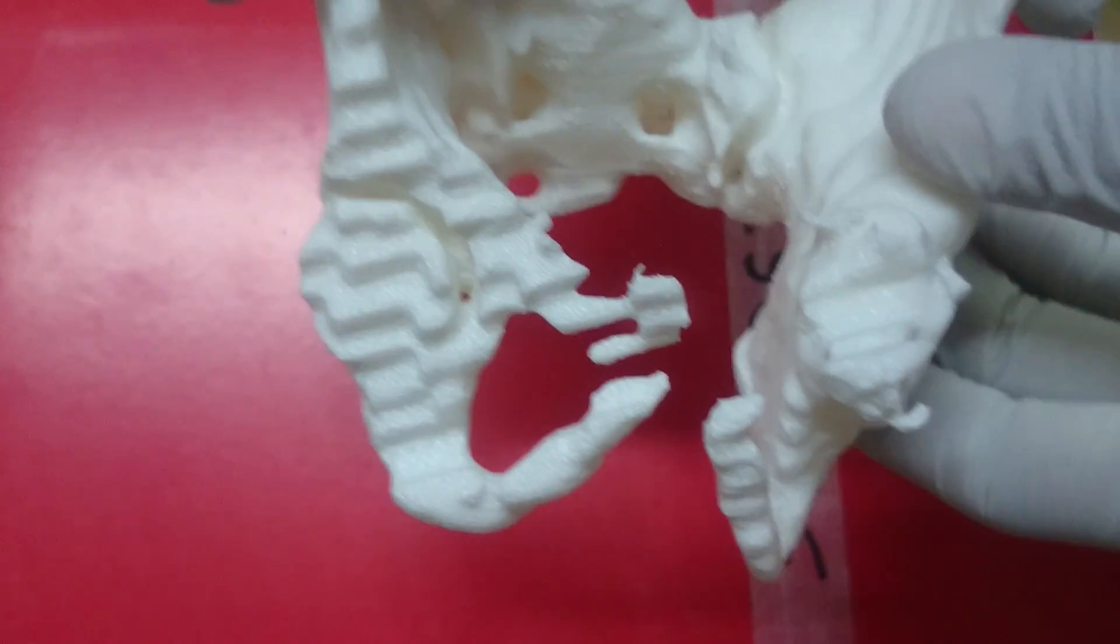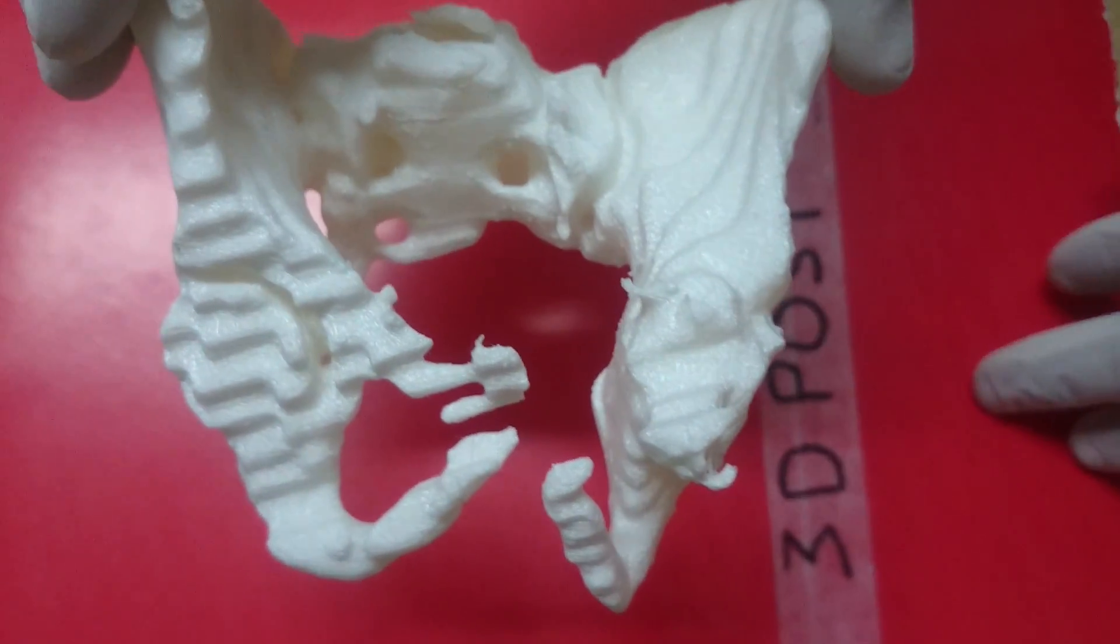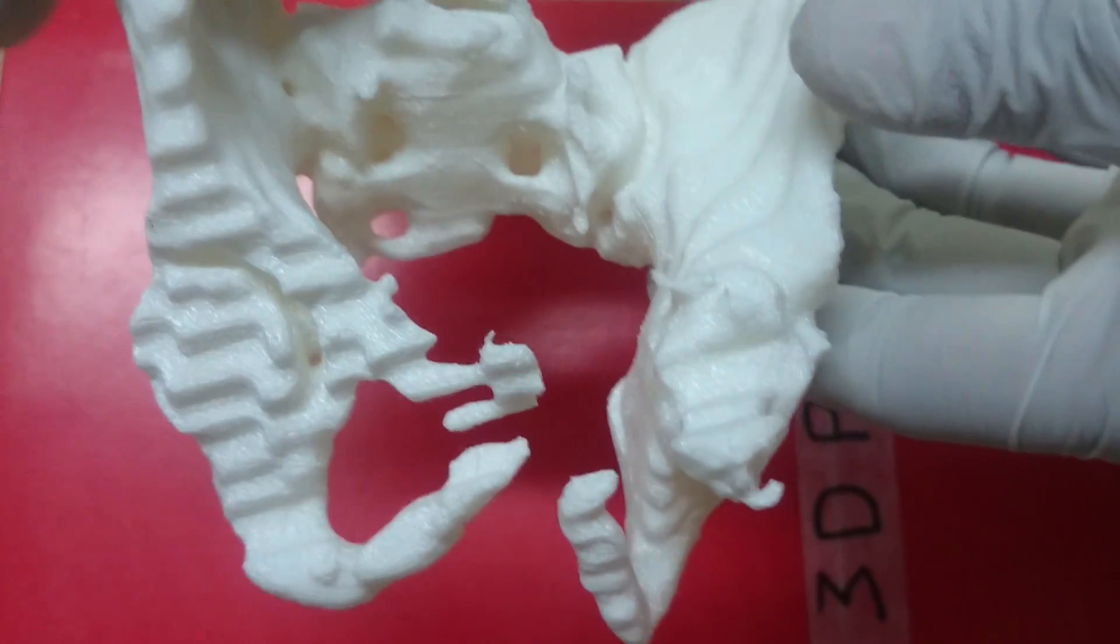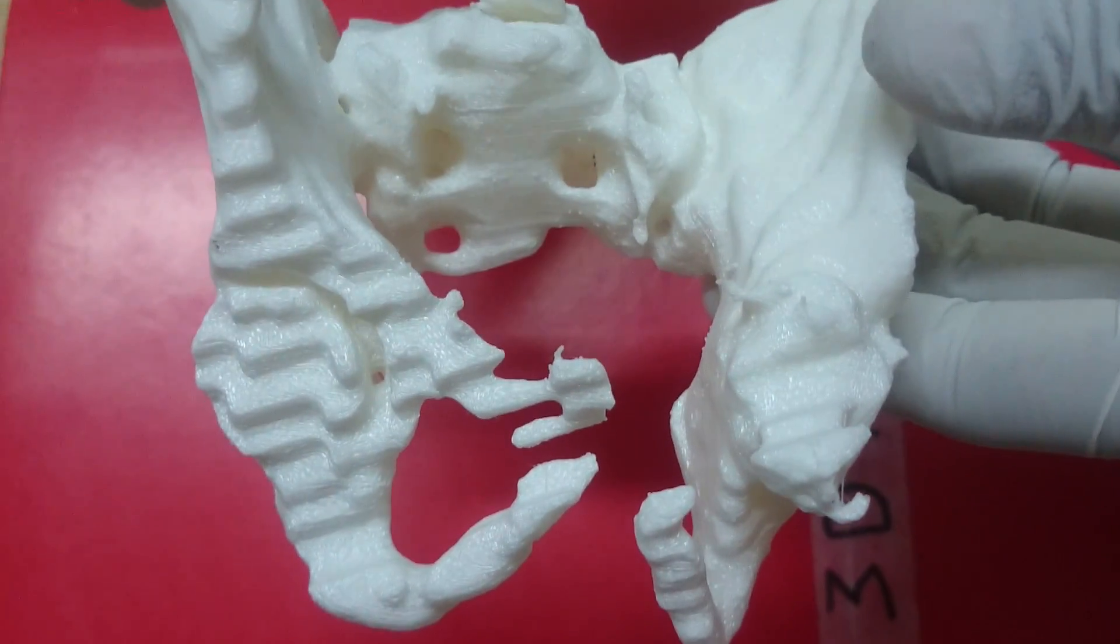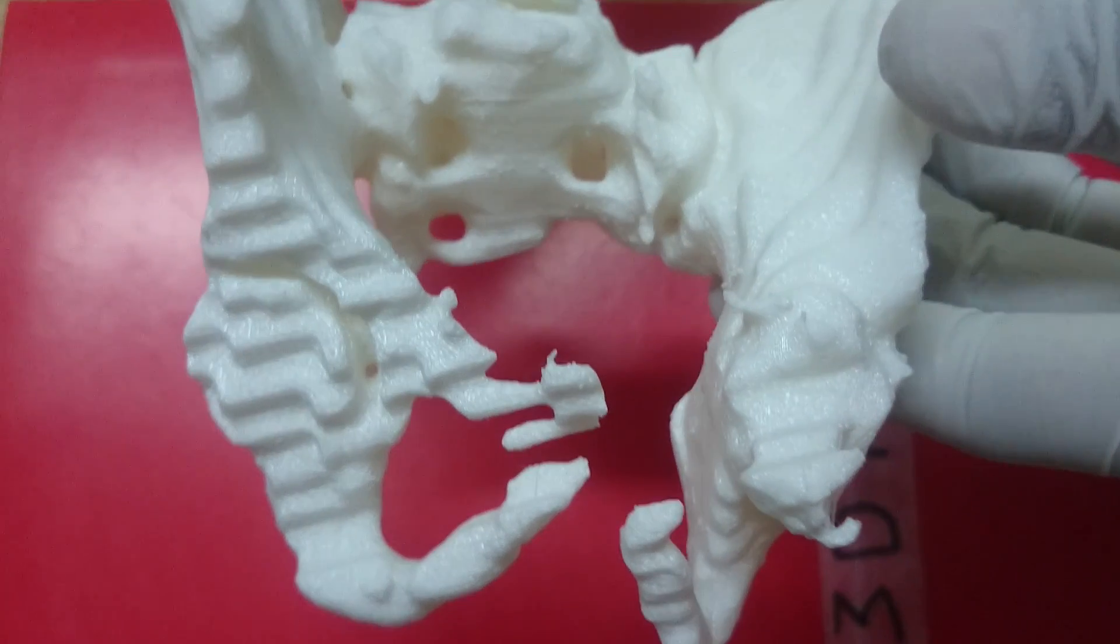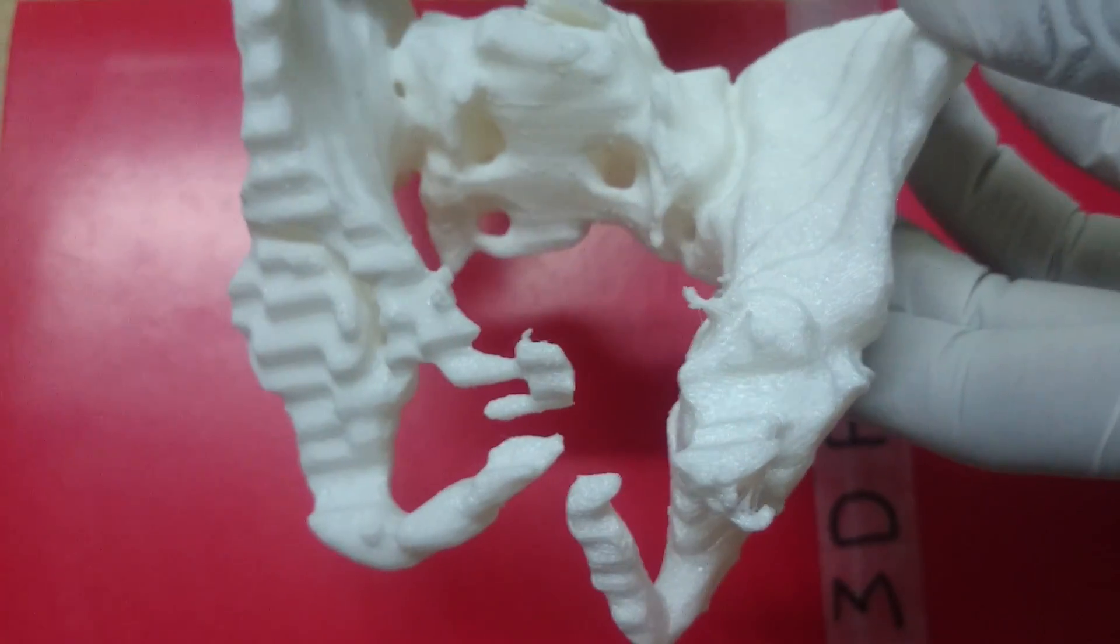This is a 3D model of a 17-year-old boy who had a road traffic accident. This model has been created from the CT images, the DICOM images of the CT scan of the pelvis of this boy.